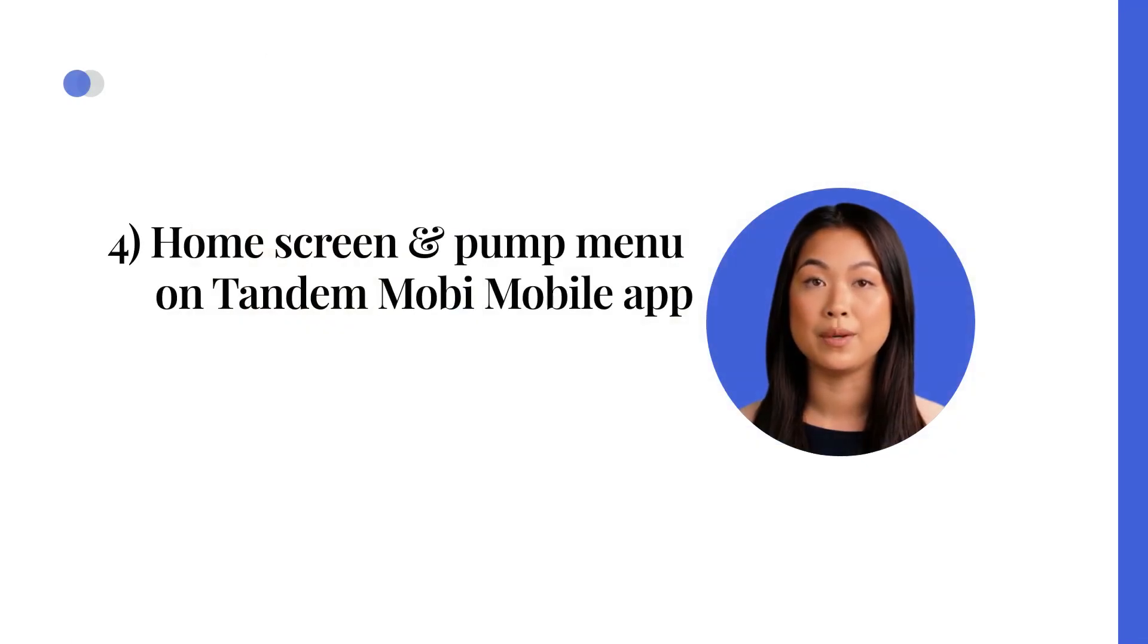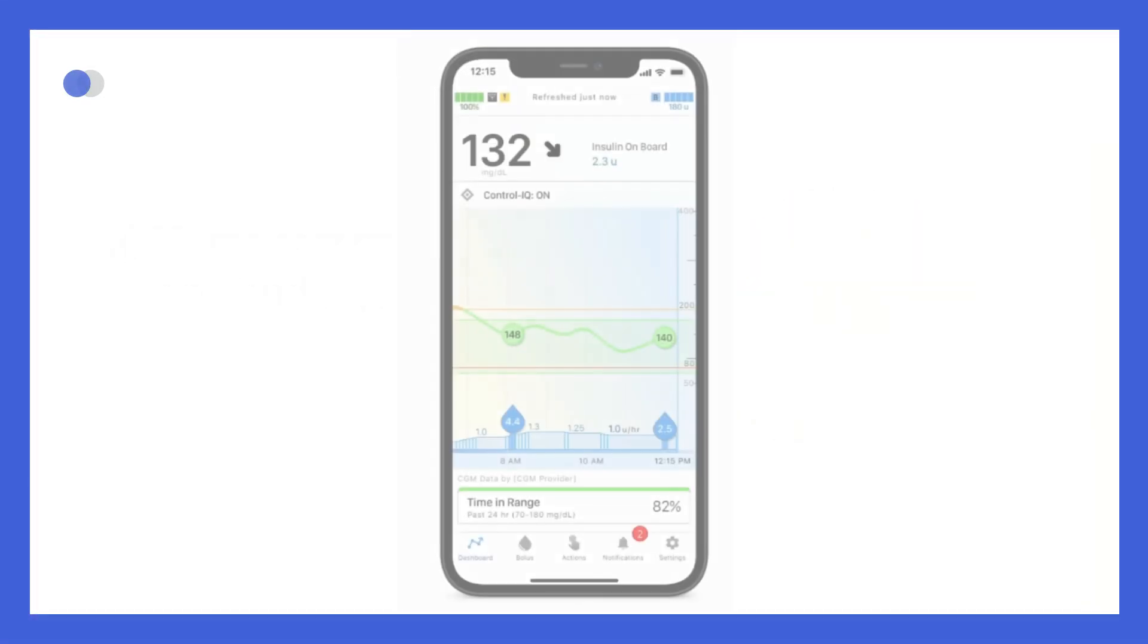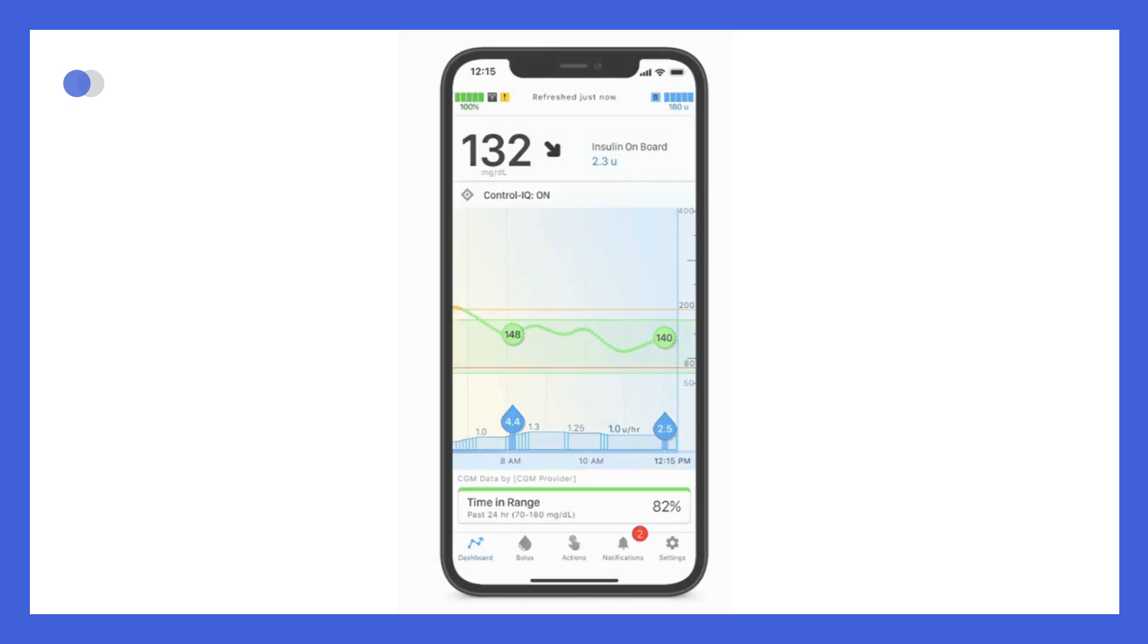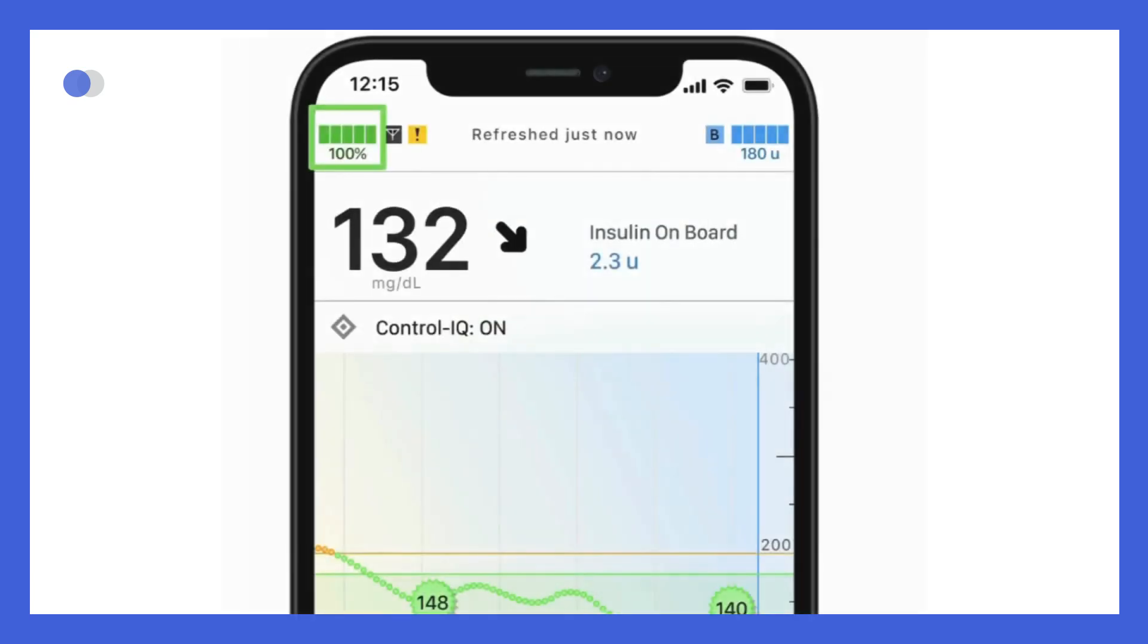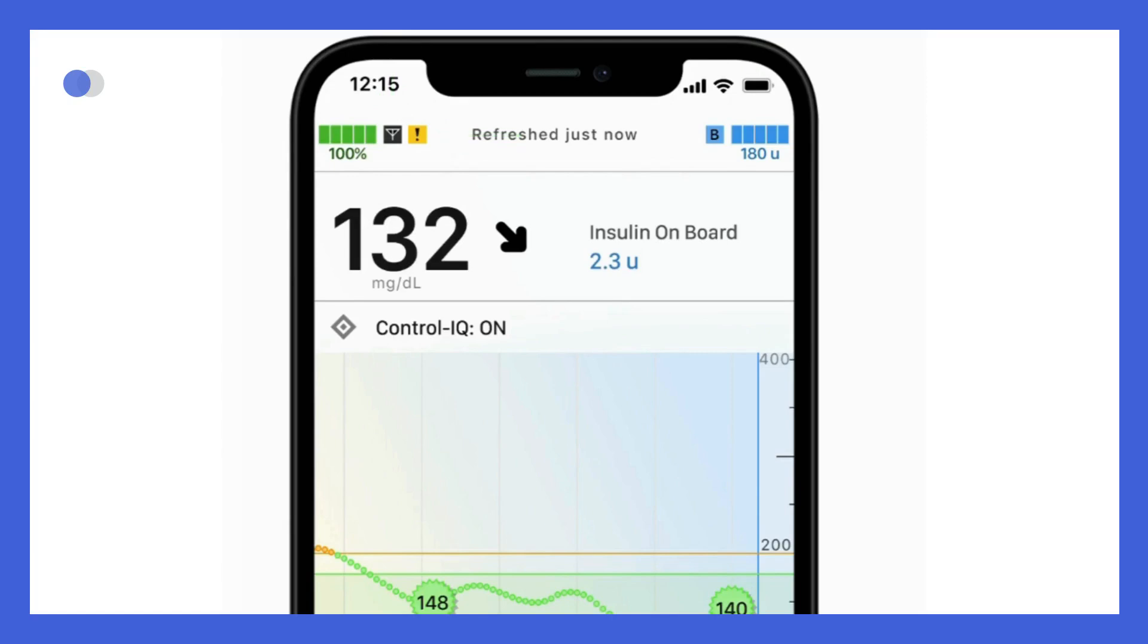Home screen and pump menu on Tandem Mobi mobile app. Now let's move on to learning more about the mobile app. We will begin with an overview of the dashboard. Once your pump has synced with the mobile app, pump data can be viewed on the mobile app's main screen or dashboard. At the top, the mobile app displays the pump battery level. Please note that this icon is different from the phone battery level, which is shown on the top right corner of the screen. The antenna icon shows CGM communication status and next to that, alert status is displayed when an alert is active. On the top right, you'll find the basal and bolus delivery status icons, as well as the amount of insulin remaining in the cartridge.